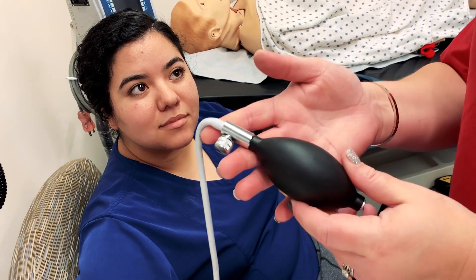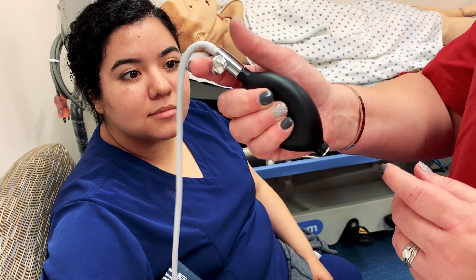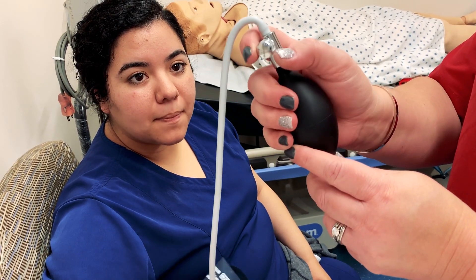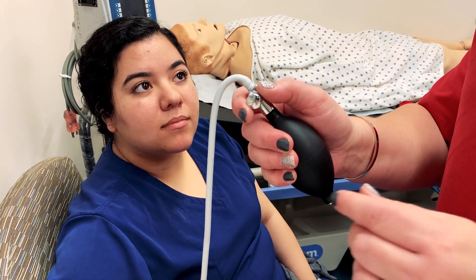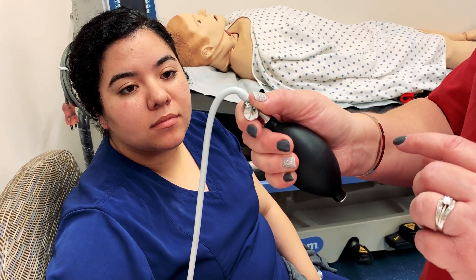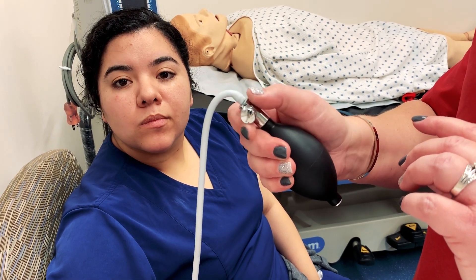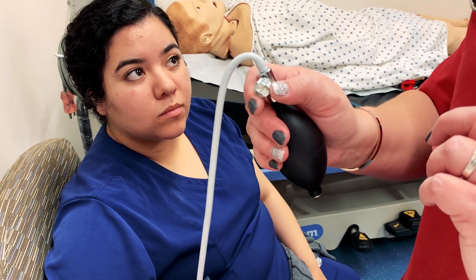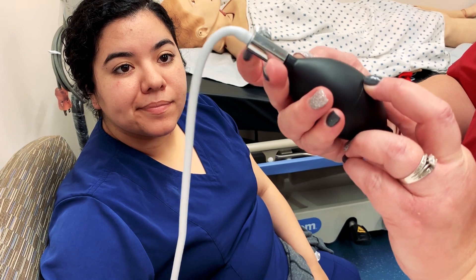The way that I like to hold the ball is to hold it so that I can squeeze with the palm and these three fingers, and then I control this dial with my thumb and my forefinger. The first time you go to pump, you want to make sure that this valve is rolled all the way backwards towards you — that means the valve is closed. I'm going to try to zoom in and show you the little hole.